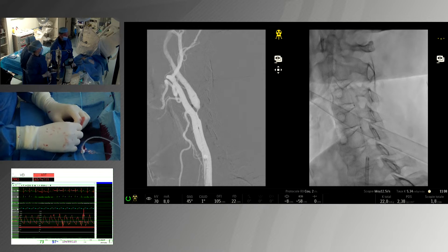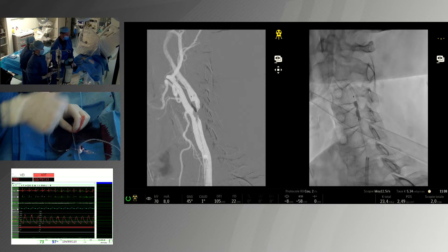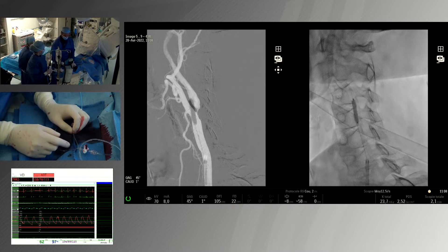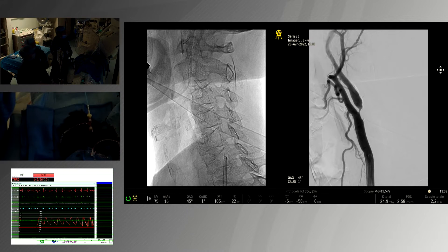You can see that the balloon crosses quite easily. This is a watermelon effect at the stenosis. It's about four atmospheres. We check after the angioplasty.